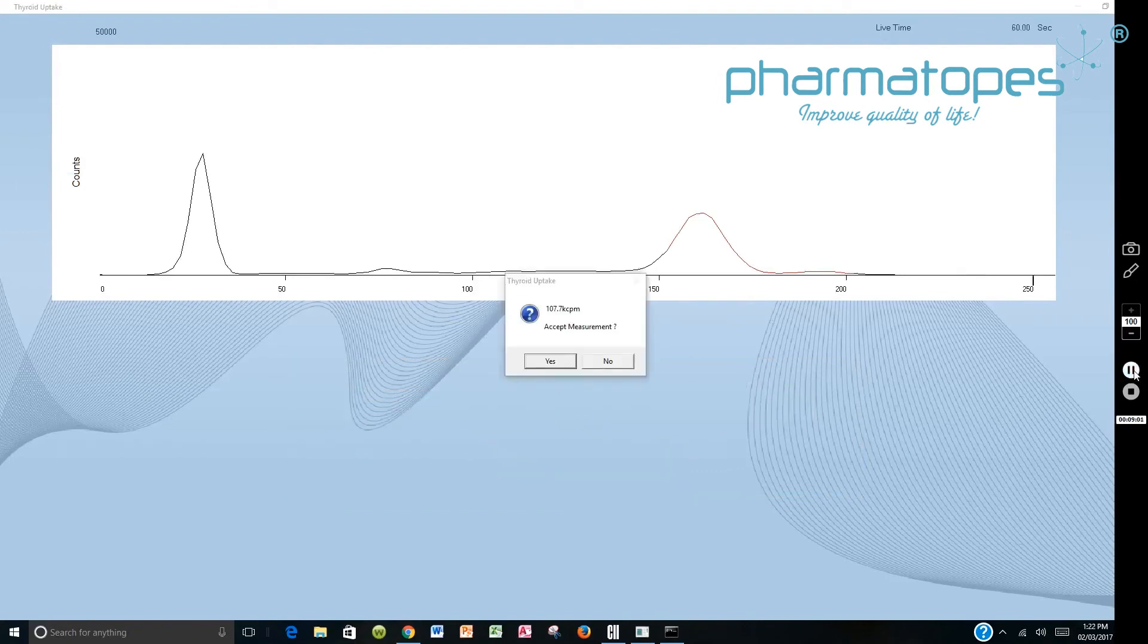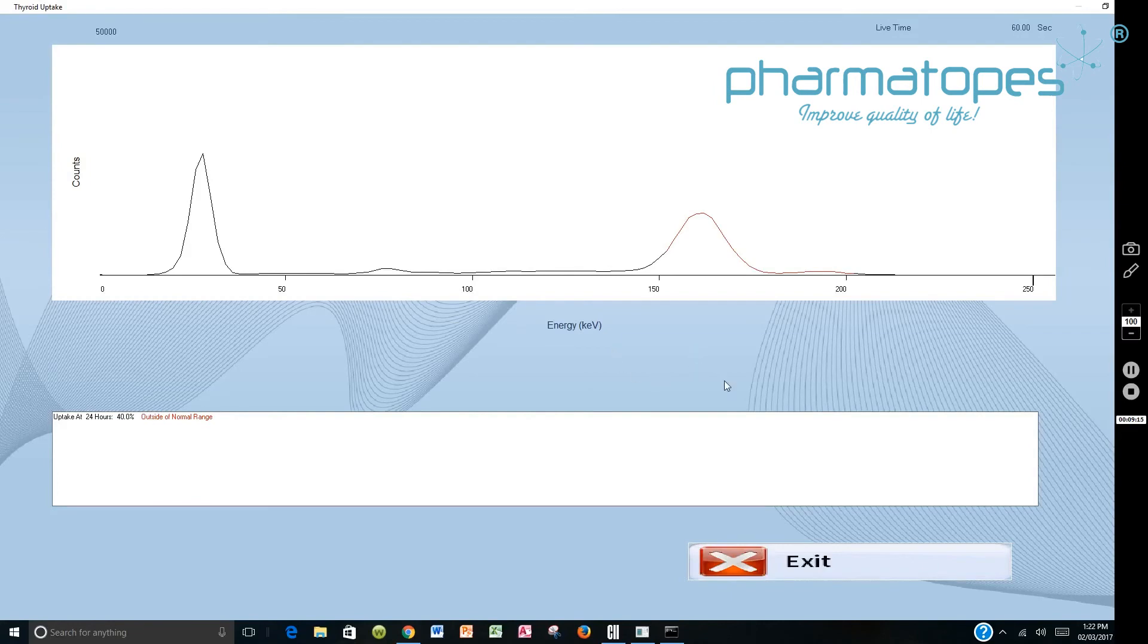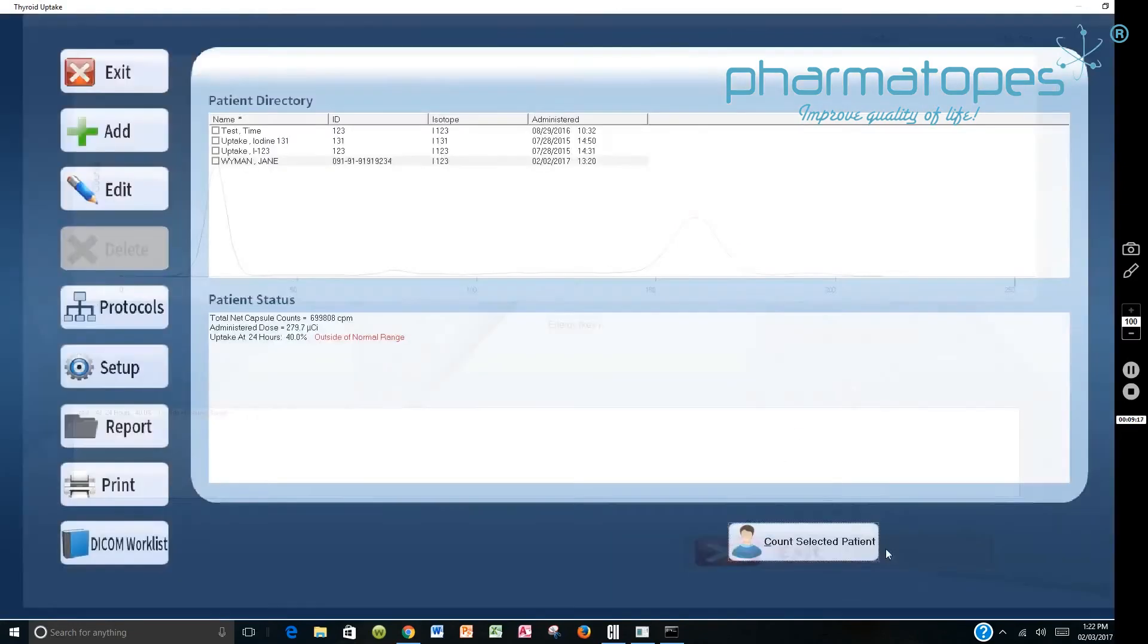Once the neck count is completed, then you can review the spectrum and you can accept the measurement. Once you've accepted the measurement, it will then provide you an uptake at the 24-hour period there. So once you've got that information, then you can exit out of the program here.